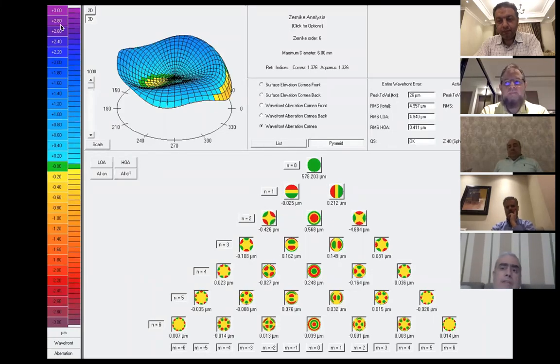After 3 months, you can guarantee that you can take an IOL and put another one in the bag. But after one year, are you sure that you can do the same surgery? It might not succeed as you want it to. So we have to be careful, as you said, with mapping and selecting the patient for multifocality.